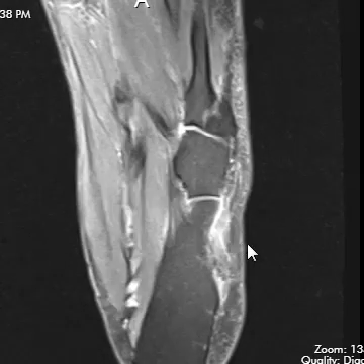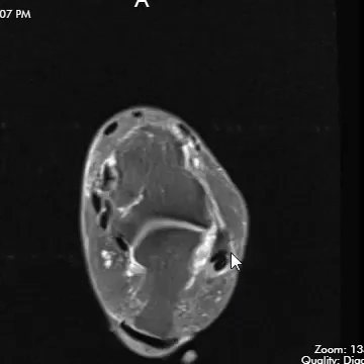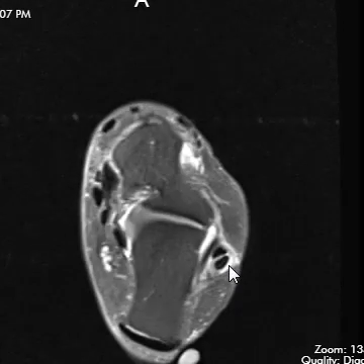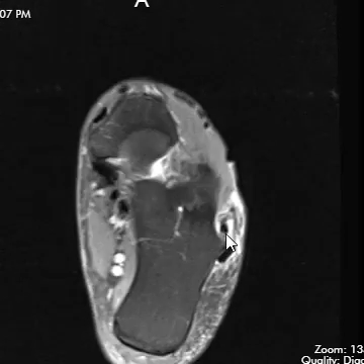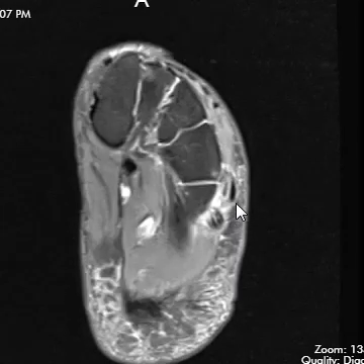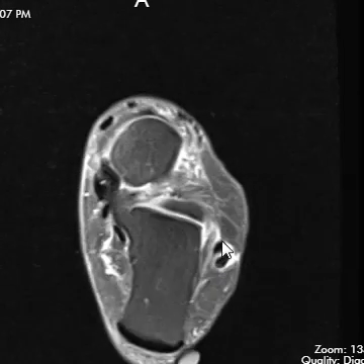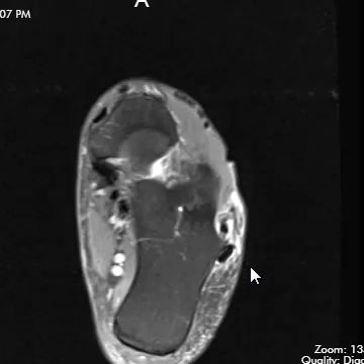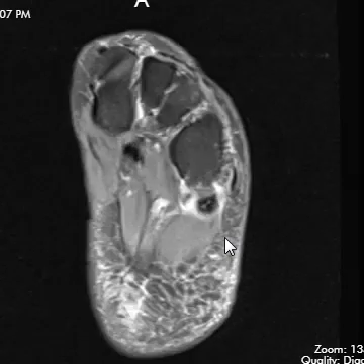Now we're putting up the view with the foot in plantar flexion, toes pointed down. We can see the peroneal tendons above the ankle. Coming down to the inframalleolar portion — here's the brevis in the front. Before it had completely disappeared, but now we can see it coming down. We know it's not torn. Looking at the peroneus longus tendon, here's the longus — you can see fluid in the tendon sheath. Coming down to the peroneal tubercle, and going a little further, we see it split into two separate components. This is a longitudinal split tear beginning at the peroneal tubercle and extending to the cuboid bone.